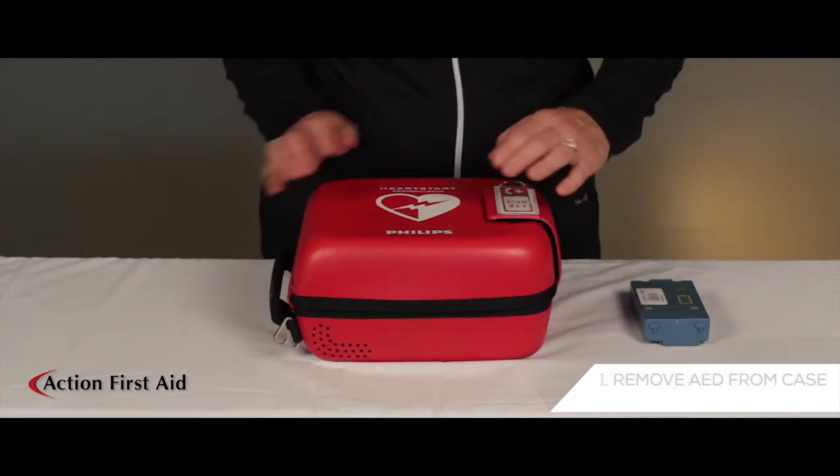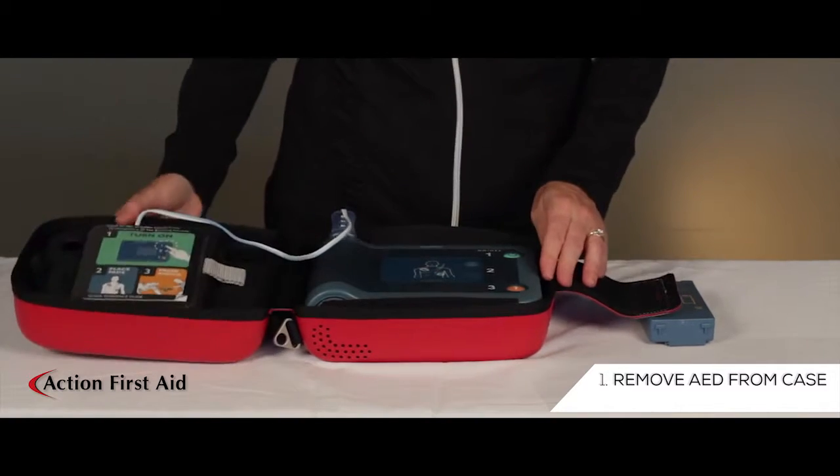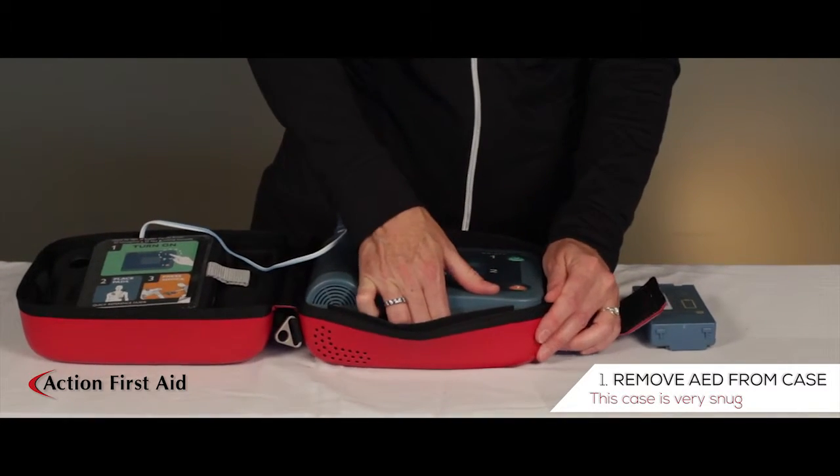Remove the machine from its carrying case. Be advised this case is very snug.